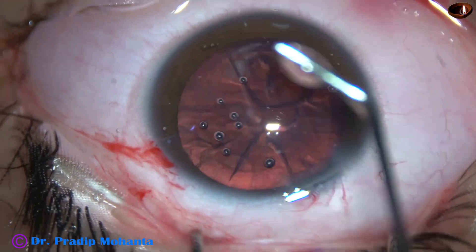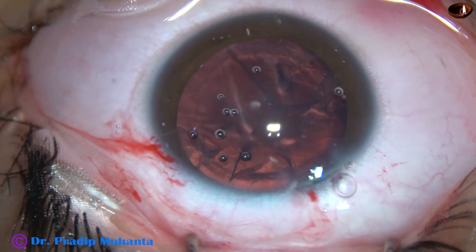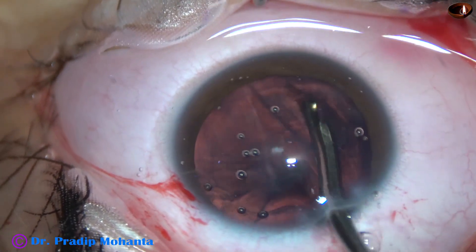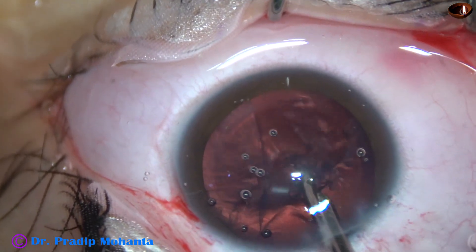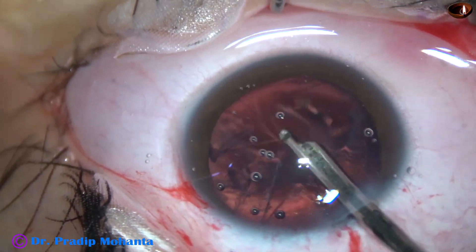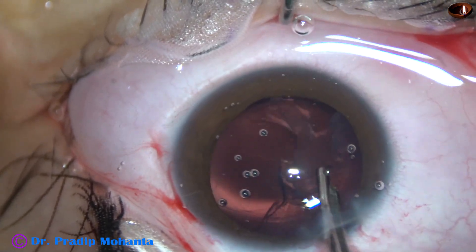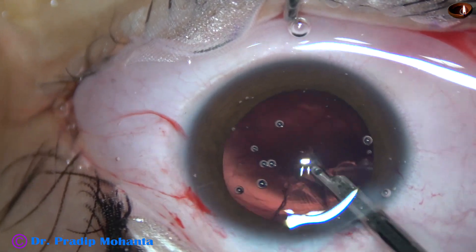I didn't want to try aspiration of cortex with the FACO probe itself in this case. I want to employ a safer way because the patient is very young and highly myopic — this eye has myopia of minus 20 diopters. The intraocular lens selected in this case is +4.5 diopters. The cortex is being cleaned.